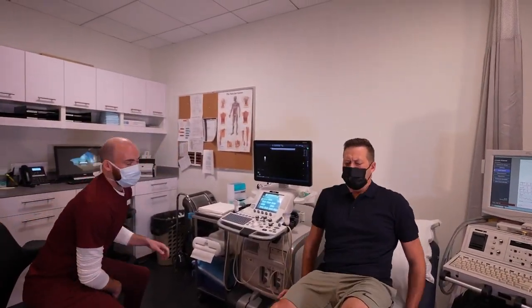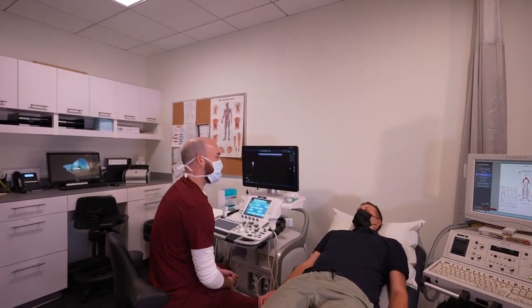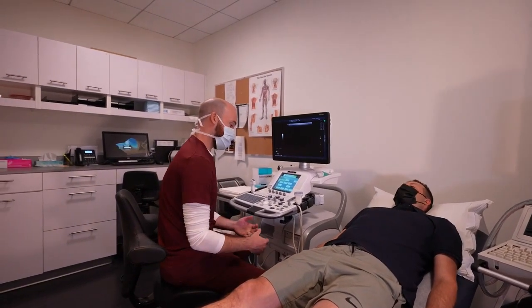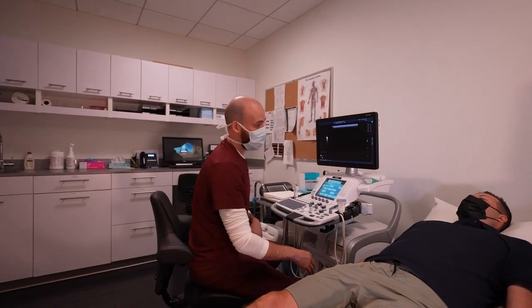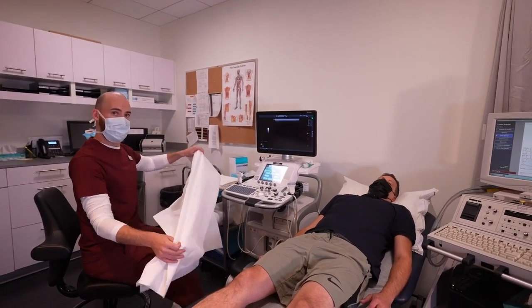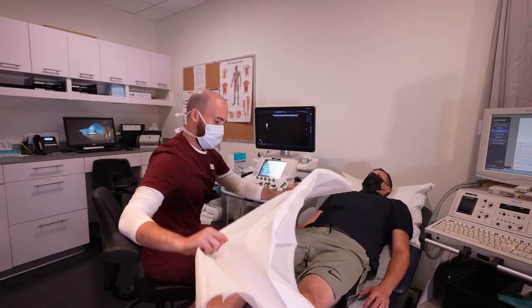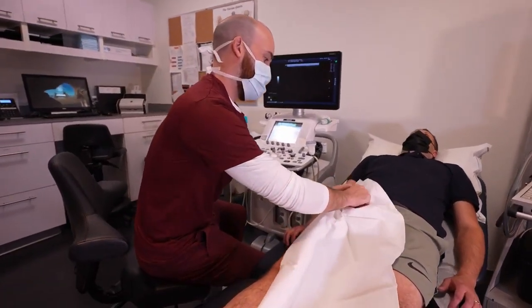There's a separate changing cubicle in each room for the patient. Depending on what test is being performed, you may be asked to change into a pair of shorts. Once the patient is changed into the appropriate attire, the patient will then be asked to lie down on the ultrasound bed. And the technologist performing the scan will explain the procedure, where they're going to be looking, what they're going to be looking at, and what happens with the patient's results following the exam.